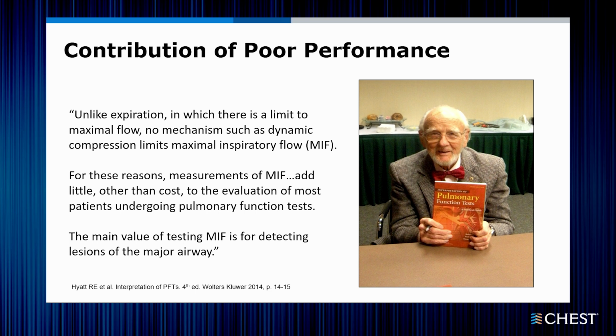And so when I inherited the role of lab co-director, we were not routinely performing maximum or forced inspiratory maneuvers as part of our spirometry. And that's because Bob Hyatt said it was a waste of time. Because there is really no physiologic limitation to inspiratory flow other than effort, he really advocated only to do inspiratory maneuvers if there was concern about a central airway obstruction.